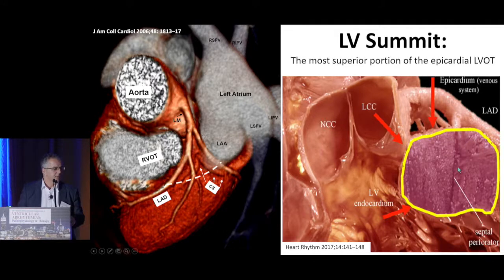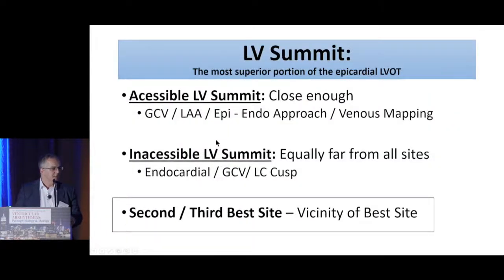different approaches here. It's also important to note that because of the close proximity of all these structures, sometimes the given target is as far or as close to many different of these anatomical structures. And for you to succeed, you have to ablate from different sites.